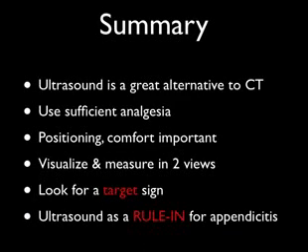So in general, ultrasound is a great alternative to doing a CT scan. We want to think about giving the patient some analgesia. It's important to have the patient in the right position of comfort, and always look at things in two views. We've talked a lot about the pylorus and the intestines and the heart. Whenever I mention an organ, you'll notice there's a recurring theme here. I talk about looking at things in two different views, and you're reconstructing that anatomy in your brain in a three-dimensional image, and that will come to you over time.